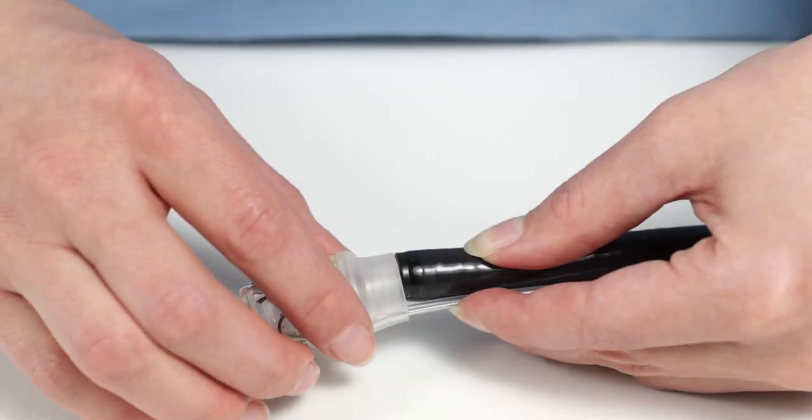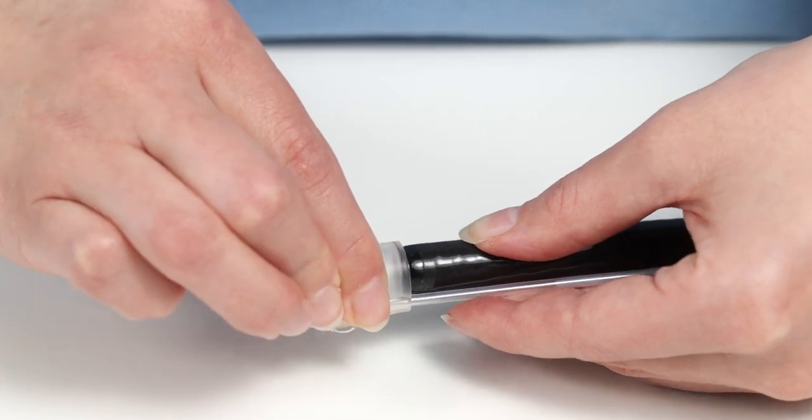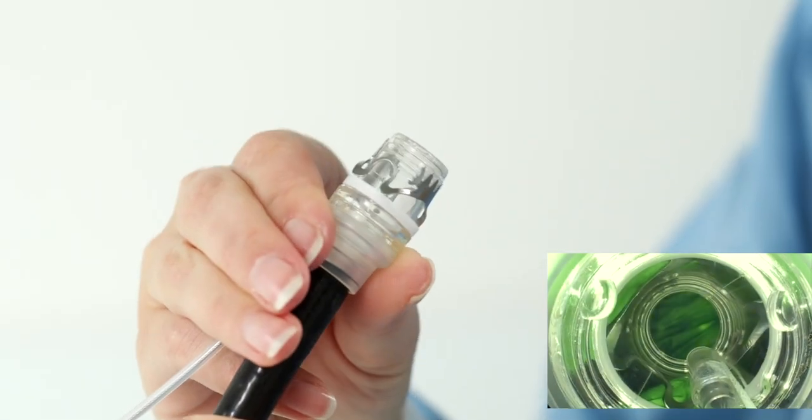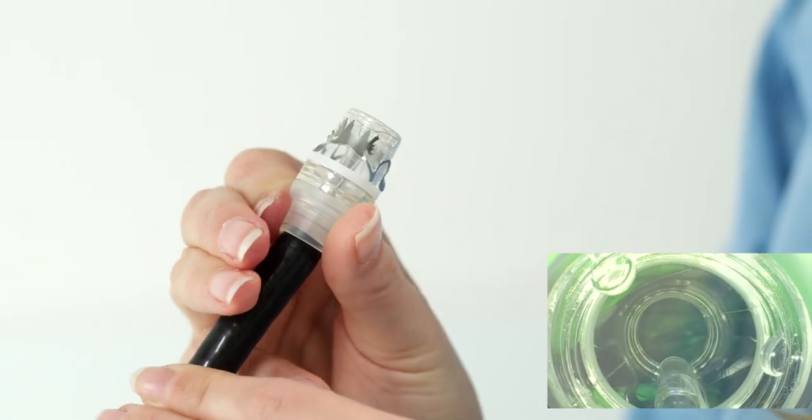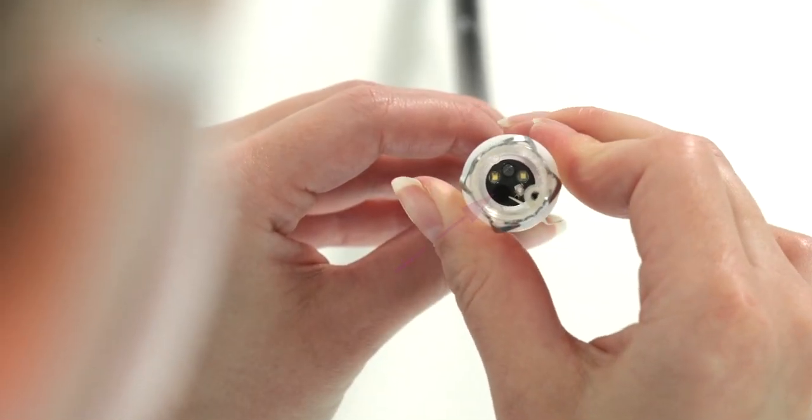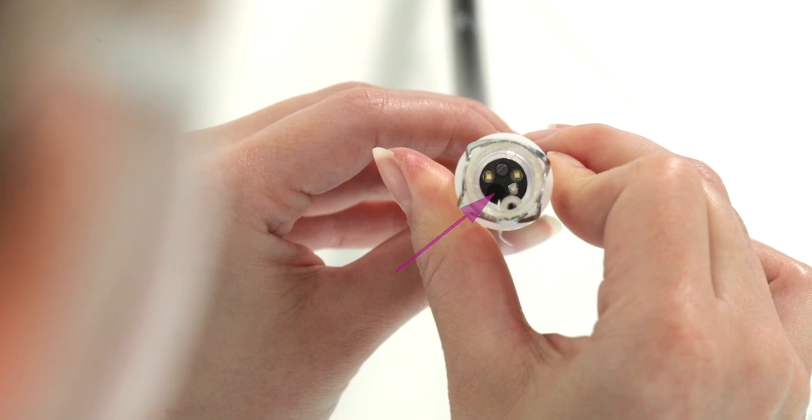To start, place the application cap only lightly on the endoscope tip. The release thread must enter the working channel vertically and not conceal any of the endoscope functions. The working channel should be located directly next to the snare shaft tube, so that the working channel outlet remains clear.